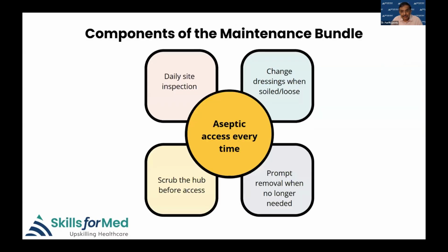Now, the components of the CLABSI bundle, again, I'm just going to emphasize aseptic access, daily site inspection, and additional things like changing the dressings when they are soiled or loose. And already Stella pointed out, scrub the hub.